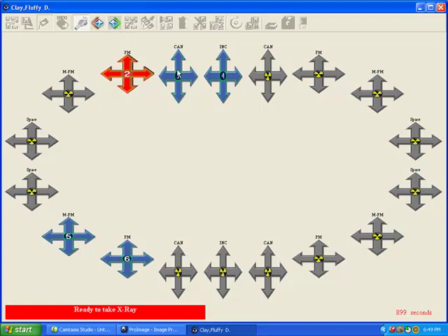For instance, if we skip ahead, we take away this one from the sequence, and now we're waiting to radiograph this tooth. Now let's say, for argument's sake, we're waiting for this exposure, but this one was taken and we have a thumbnail and we were either overexposed or we missed the apex we want to retake. By pressing this button, the thumbnail present here will go away and return back to red. And basically that's pretty much what you have going on with a standard mode.